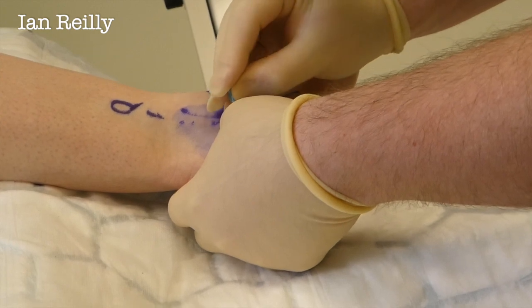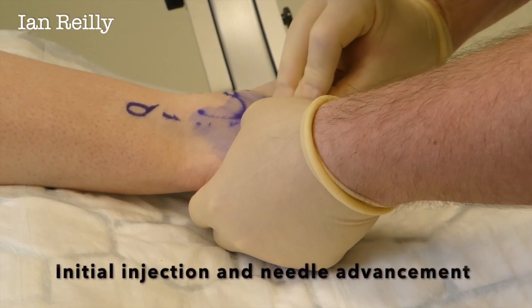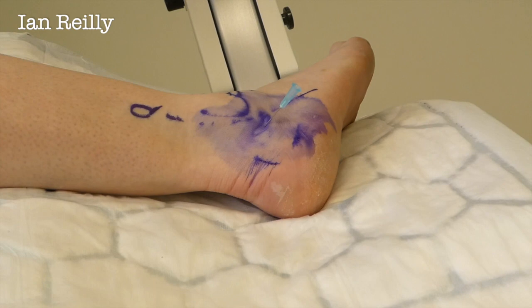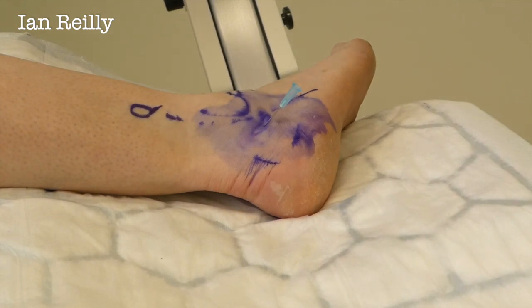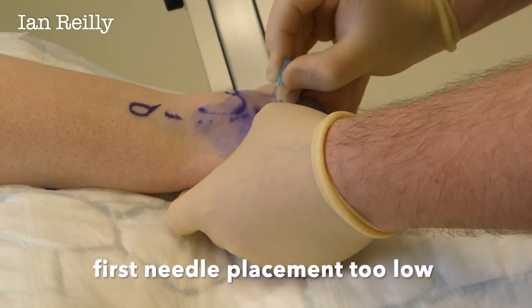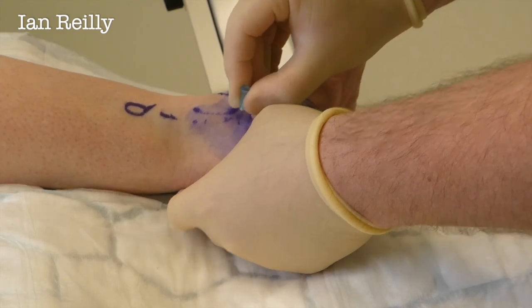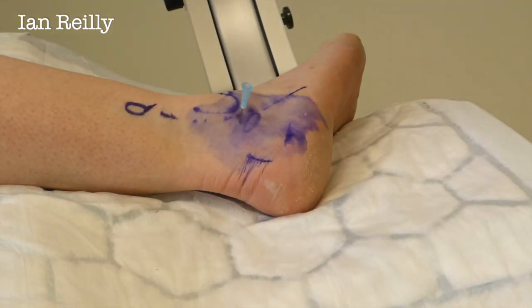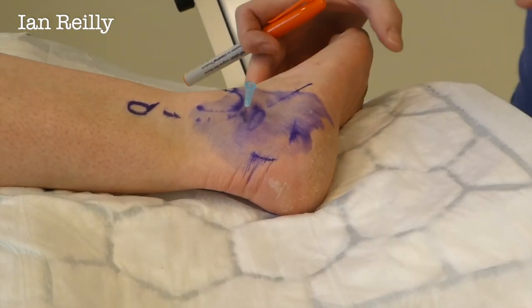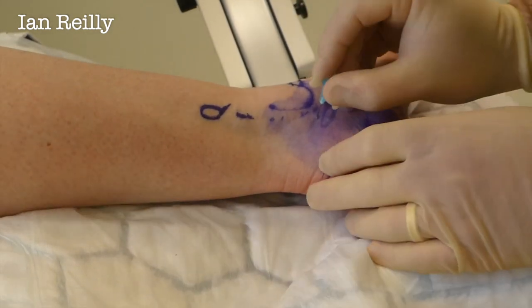Sharp scratch now. I'm going to take a flash and just see where we are. Okay, so we're going to be a little higher than we were there — we're going to come in again. That's better. Flash again. Pull that foot down — just pull that foot there for me. We're just off the edge of the screen so you get to watch what we're doing.